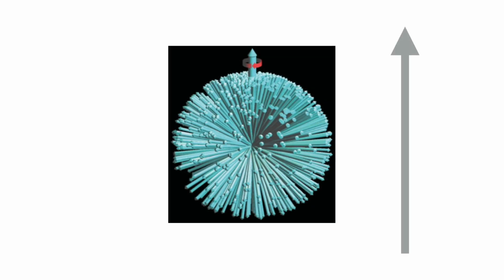However, if you place this droplet of water in a very large external magnetic field, then ever so slightly, the magnetic vectors of these hydrogen atoms start to align with the external magnetic field. And so now this droplet of water becomes its own little magnet. This is the magnetic vector for that droplet of water. And this is the magnetic vector that we see with magnetic resonance imaging.